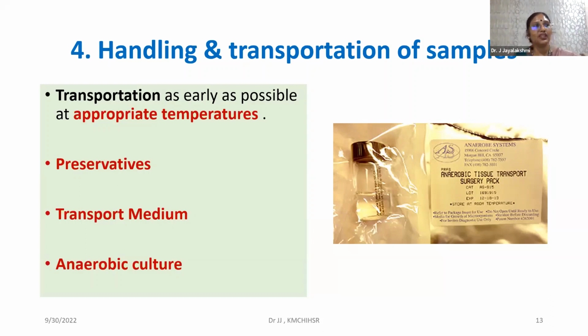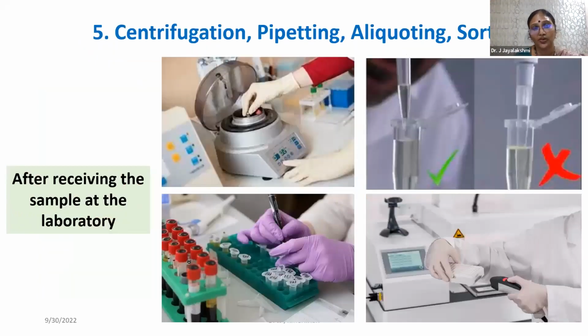So your experience of the previous few months will tell you what you need to be ready with, and there may be some surprises that you can prepare yourself for. But these are the things that are going to influence your testing, because your samples are going to come dead, non-viable organisms, and then you are expecting them to grow greatly in your cultures with the best of the system. Or you have an anoxomate to grow your anaerobic cultures, but your samples were not collected appropriately, which makes no sense and doesn't match the requirement. So it's important that we look into these small things, and it's good to walk through the process and see what happens to each one of these samples and where you should be working.